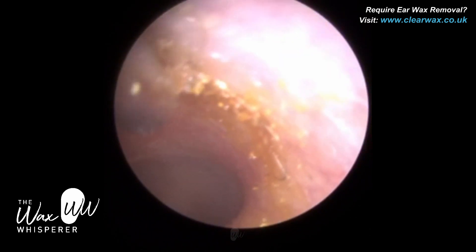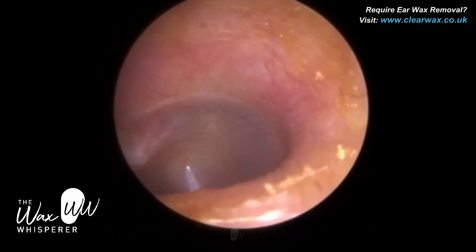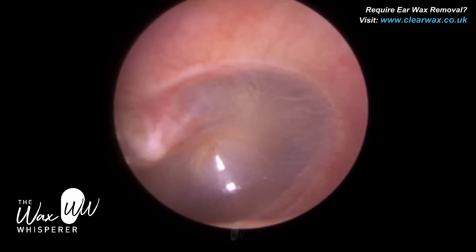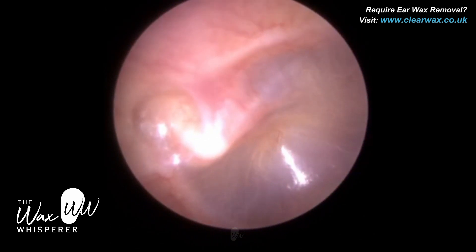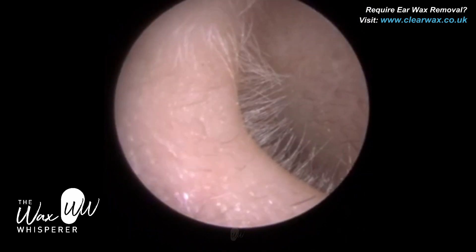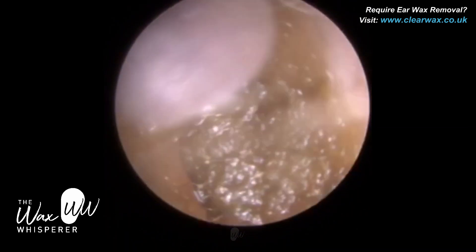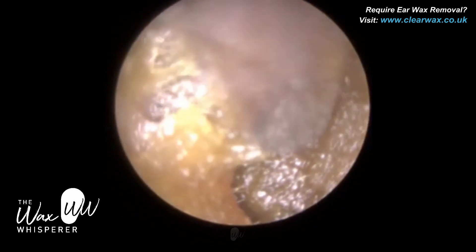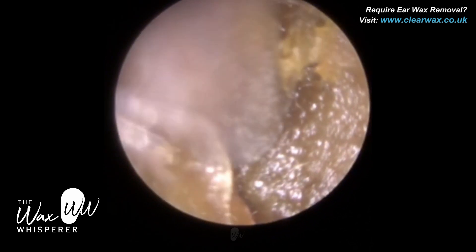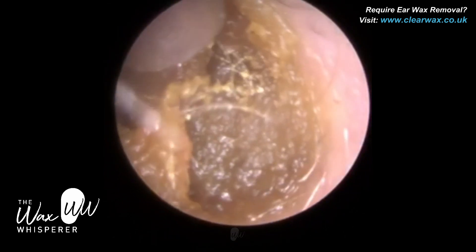Behind the eardrum you have the middle ear. The middle ear consists of the eardrum and three tiny bones — the ossicles. I'm just shining the attic part, the region where it's sucked in, that little pocket there. On the right side you can see the indentation. I'm going to let you just watch that because it's pretty straightforward — just using suction to lift the wax, which is a bit softer, off the canal wall to extract it.